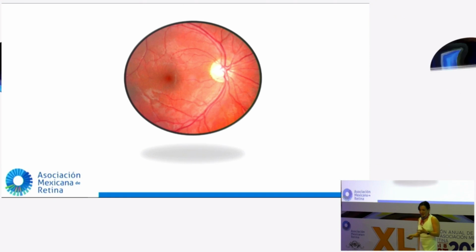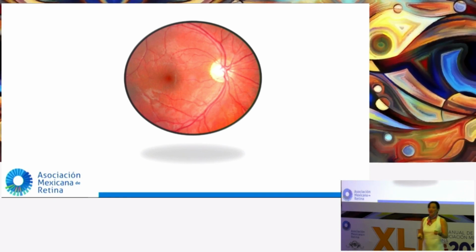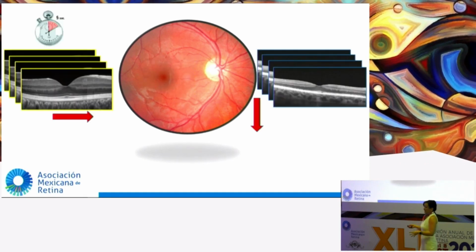This is how it goes. This is how the device works, but these are not photos. They are scans, tomographies. These are repetitive scans on the same zone in a given time span in a vertical direction, and the same applies to the horizontal direction.